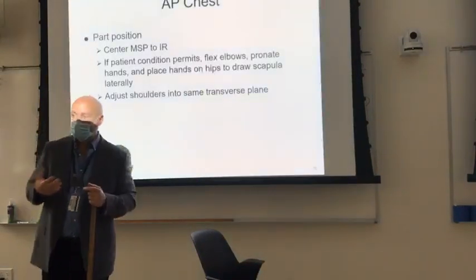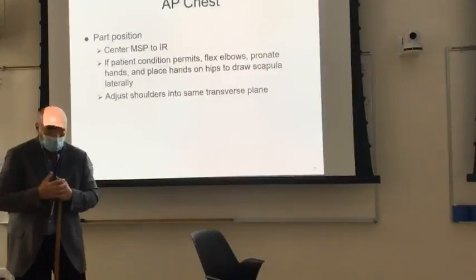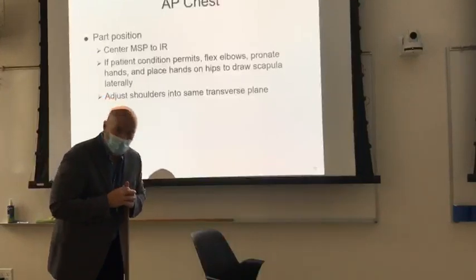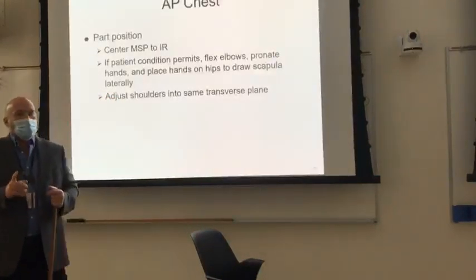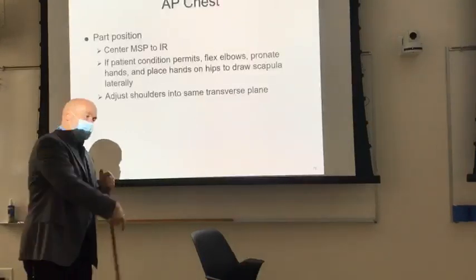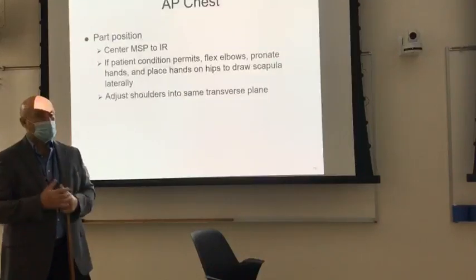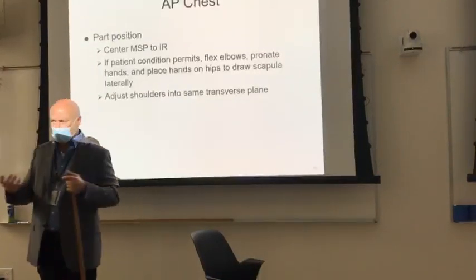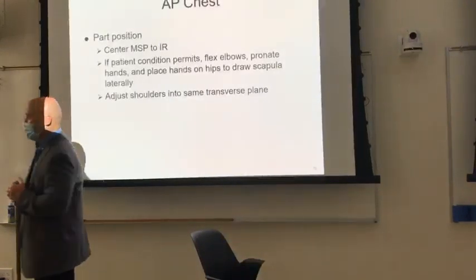I've had patients that were so kyphotic, and that's what that means, they're bent forward. Lordotic is as if you're leaning backwards, kyphotic is as if you're hunched forward. Okay? And I've had patients who were so kyphotic I had to get at the foot of the bed and angle up to be perpendicular to the sternum. I had a beautiful x-ray, but regardless of what the patient's anatomy looks like, you need to be perpendicular to the sternum. Okay?